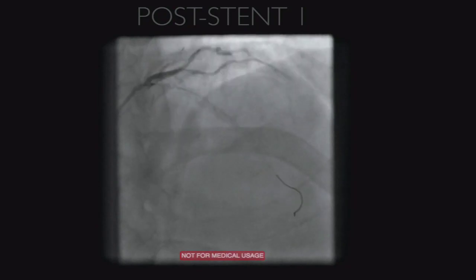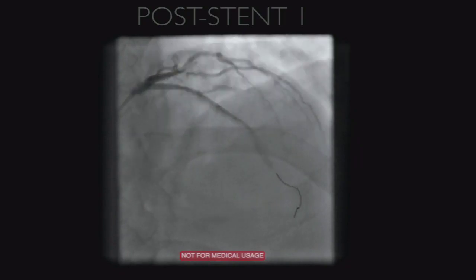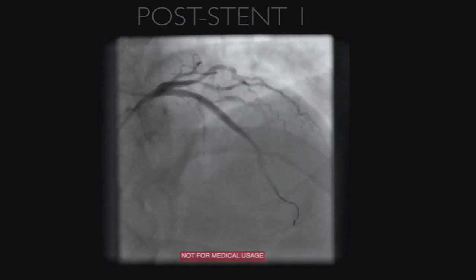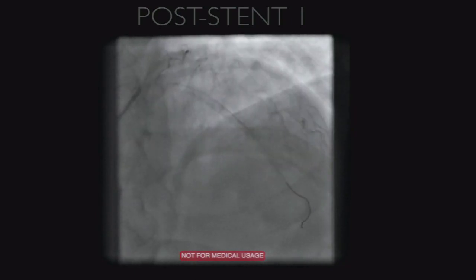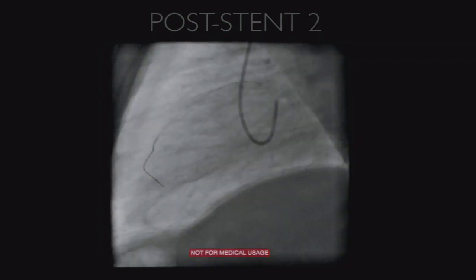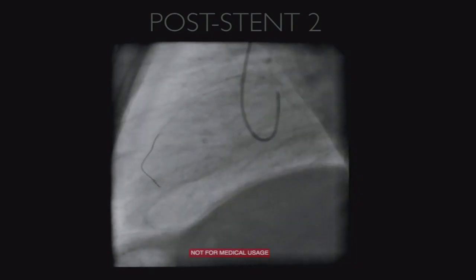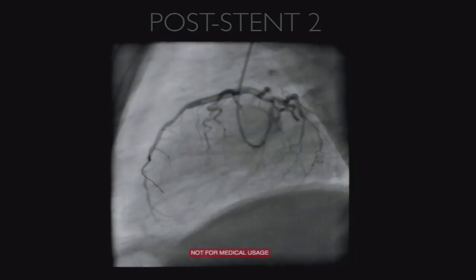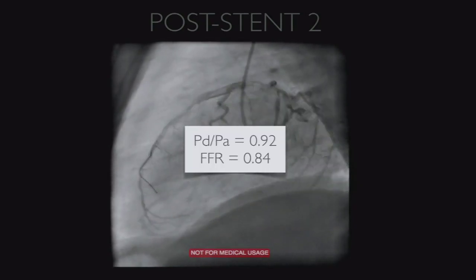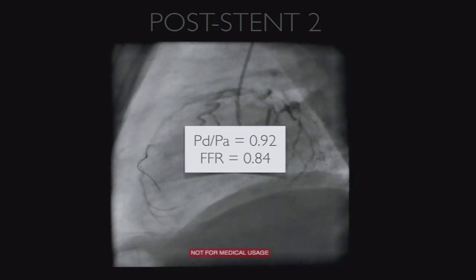And I will repeat. So you see, angiographically, I guess you will assess with me that in my view, at least, there is a slight overexpansion. There is a step up, step down, like we used to say in the old days. And so I would say again that angiographically it is a perfect result. I'm going to show you the lateral view. As you see, the clear-cut zone where the stent is covering both initial lesions, and when you proceed with the FFR, you get 0.84. Because he was obviously quite an old patient and the angiographic result was perfect, we stopped.